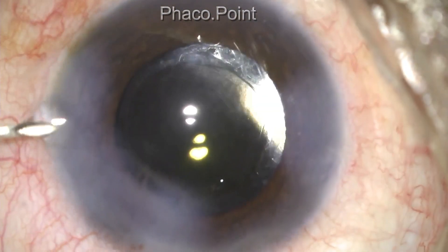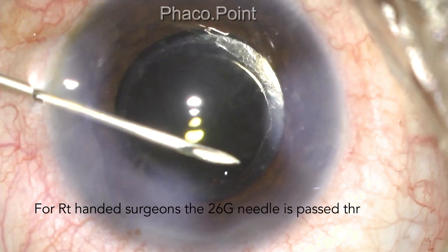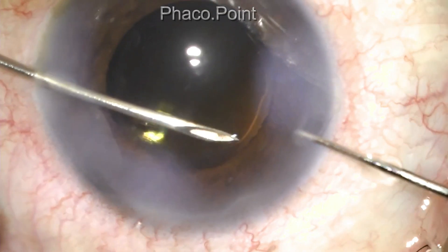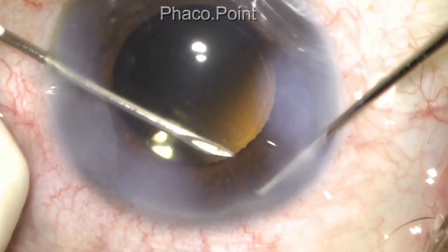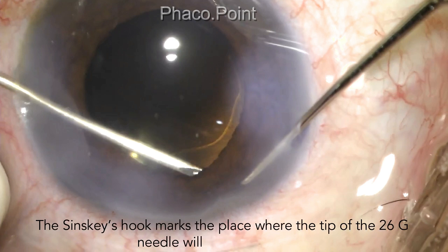At the outset, I introduce an angled 26-gauge needle into the anterior chamber and bring it and hold it steady at the area of the proposed iridectomy, close to the pupillary edge. A Sinskey hook is introduced through the opposing side port and comes to lie at that place above the iris at the proposed point of the iridectomy. The 26-gauge needle is introduced under the iris and above the capsular bag and held steadily there.